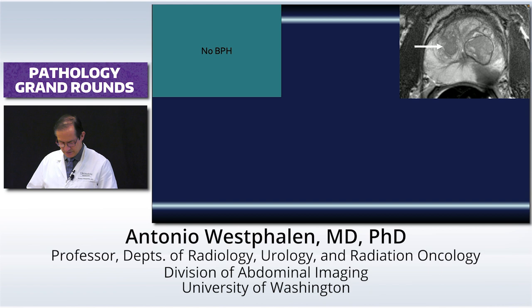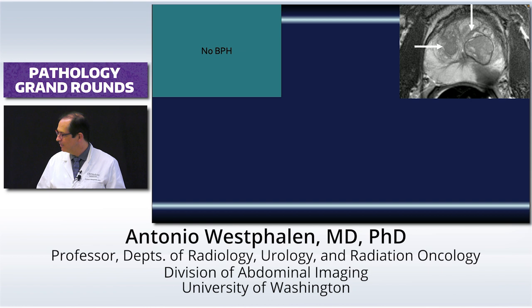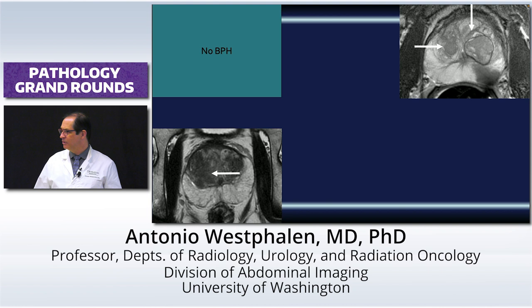And then on the top, you have those bands of tissue that just run between nodules. I guess they're just support tissue, mostly, or scars, or whatever they are. But those are also easy to identify. Okay, probably nothing, fairly easy. And then you have the score 3, which is something like this here, which is quite not nodular, still dark, maybe little specks. So this is a score 3.